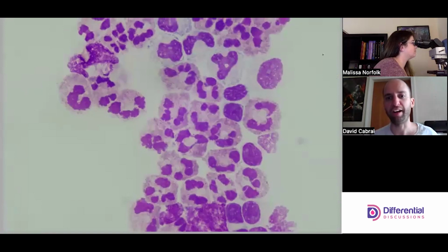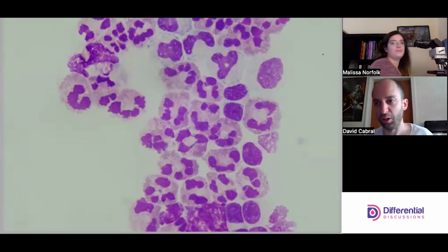Yeah, and this might be a good area where you can actually find a crystal or find bacteria or something like that. Yeah.